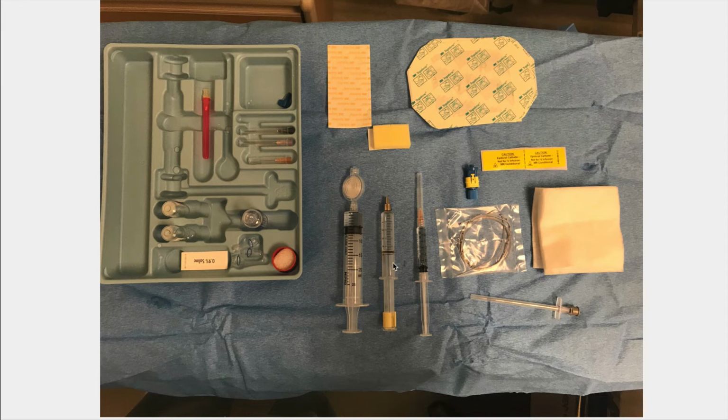This is the syringe for loss of resistance. You actually want to take this little yellow piece off here so it glides nice and smooth. This you drop saline in. This is a little syringe with a fine needle for creating a wheel to numb up the area. This here is a cap that goes on top of this epidural catheter once it's in place. Gauze for just cleaning the patient up.